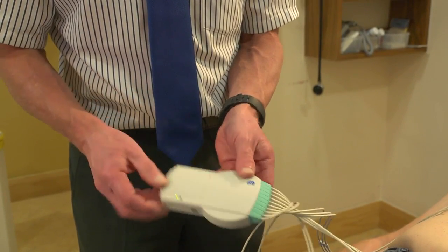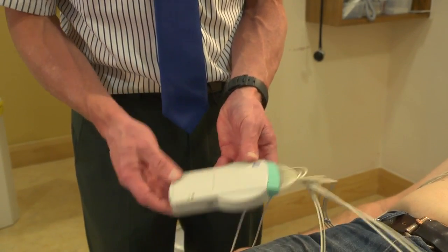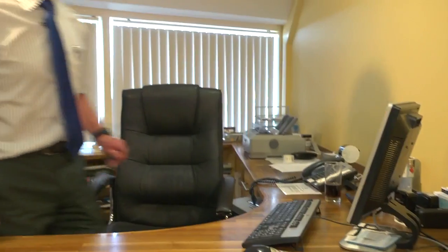Now I simply turn on the device by pressing the button, and I get a green light to tell me it's on. I now have to do no more with the patient except ask him to relax while I go over to the PC and click the button for the software, which will actually take the ECG. The patient is on the couch and the ECG machine is turned on.